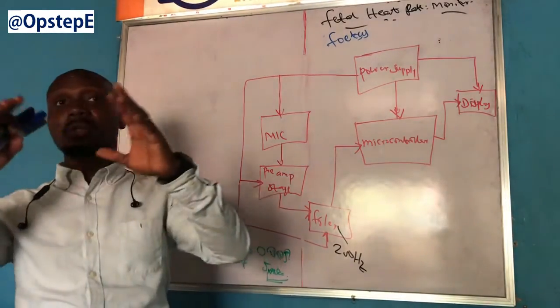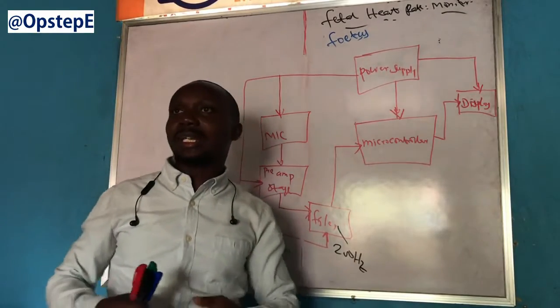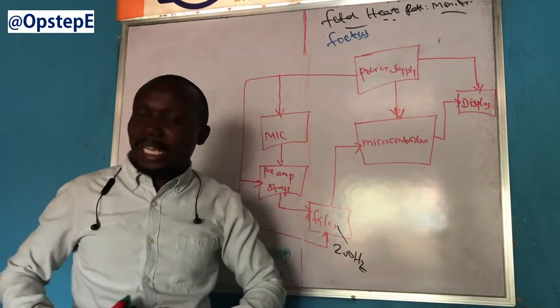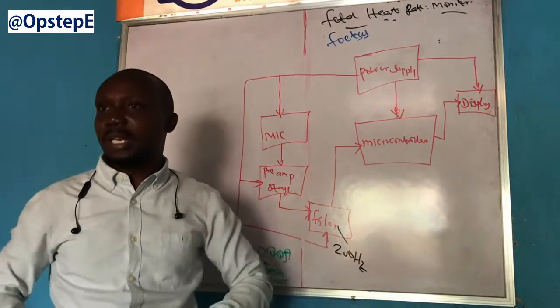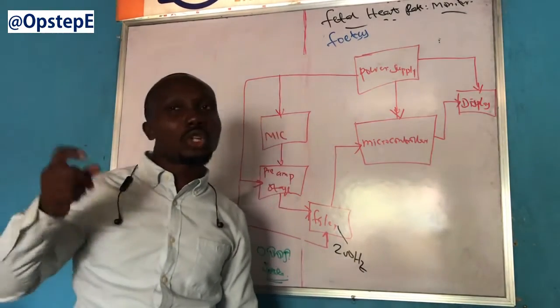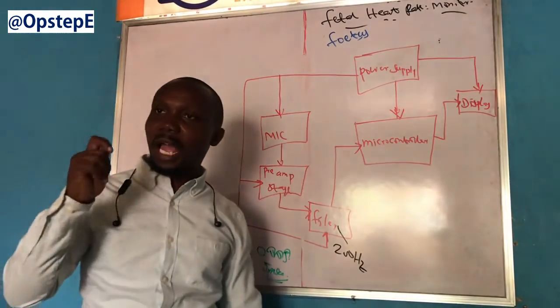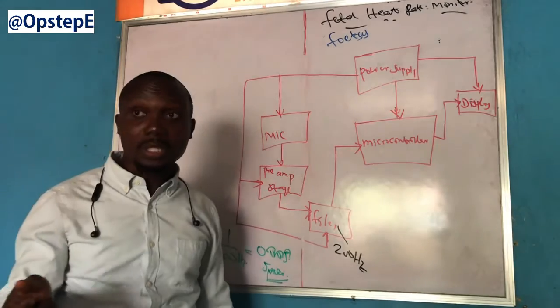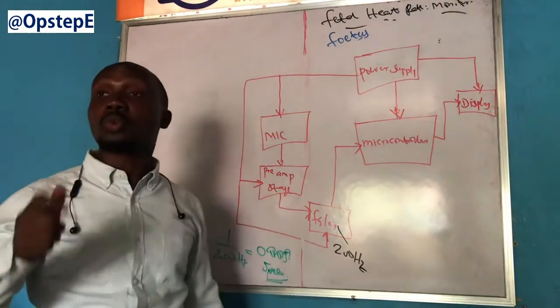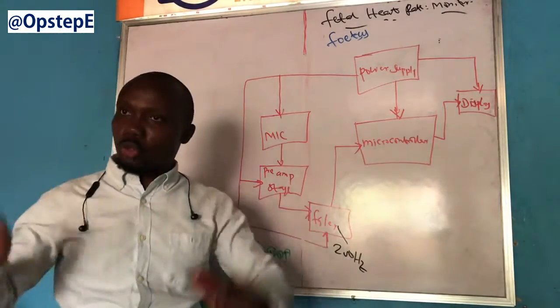Of course, it's going to be in a membrane with liquid, inside the womb, and then you have the woman's stomach and every other thing that covers. Apparently, for the sound to be received at all, this microphone must first have a very, very high level of sensitivity, which of course means it could also pick up overriding noises, and when it is amplified, you have more noise amplified.